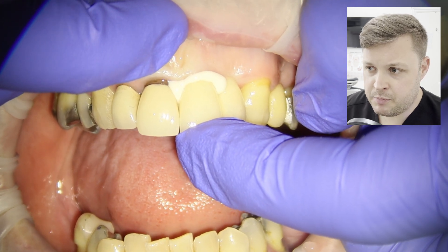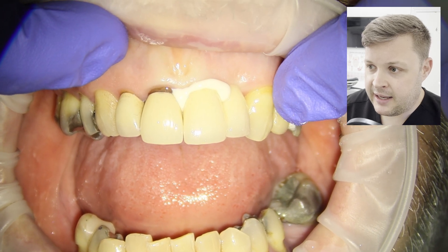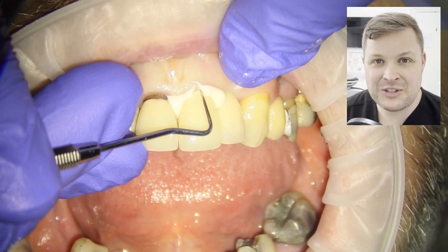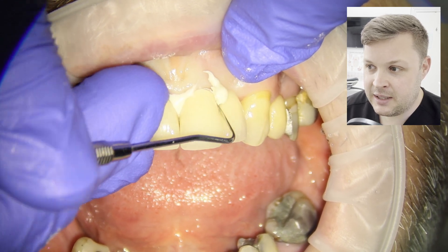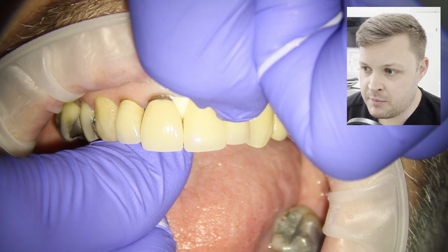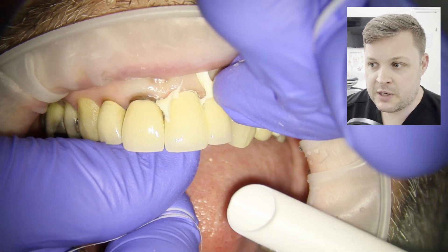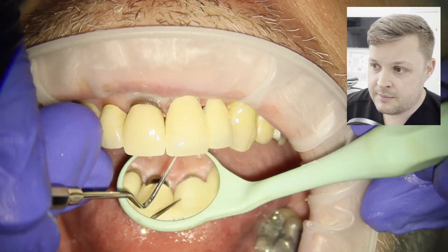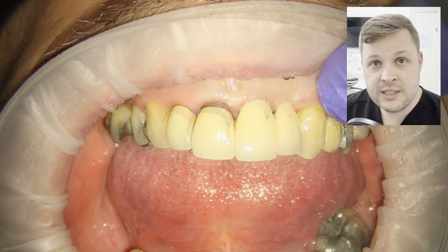There's a slight debate about whether to push hard when cementing or have the patient bite together — sometimes I like them to bite, sometimes I leave it. Similar to the temporary material, I don't want the cement to set completely before I start removing it, because Ketac Cem can be difficult to remove from between the teeth when fully solid. I remove the excess from underneath the bridge using floss hooked underneath it.